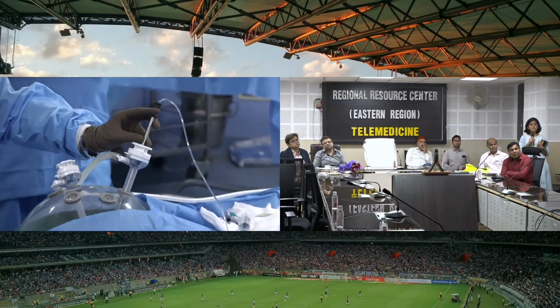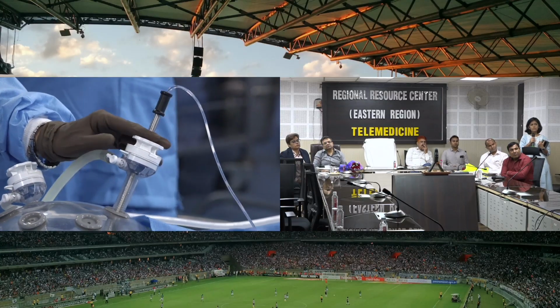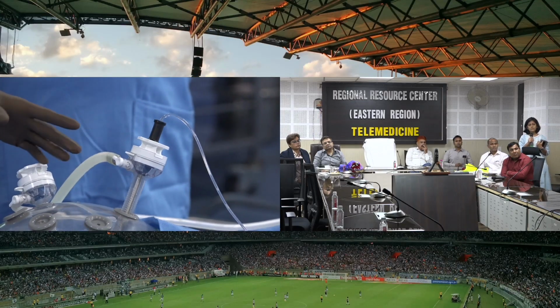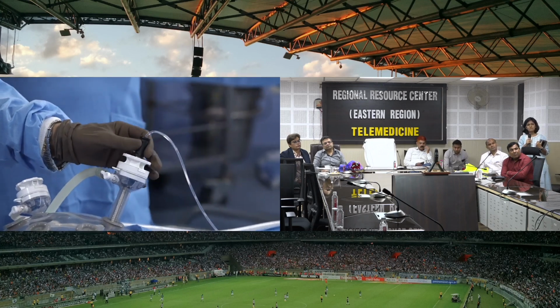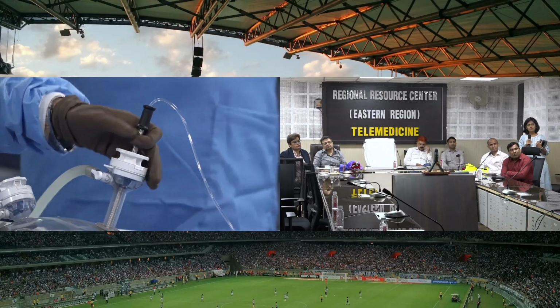New trocars have to be used. It is a completely disposable setup. You cannot reuse any of it. Think of it as doing a transplant procedure, where you remove everything away. So it generally doesn't sink down, and as I told you, the tip where you put the capnopen is very important.